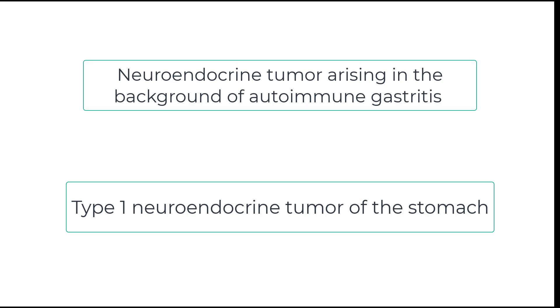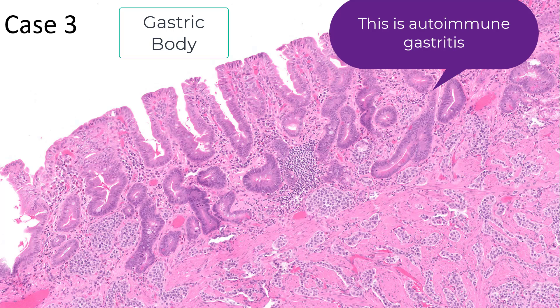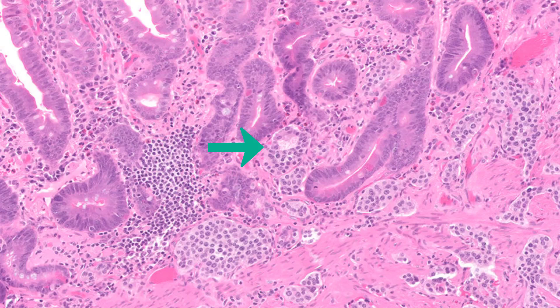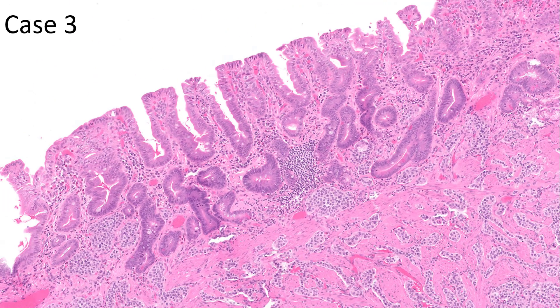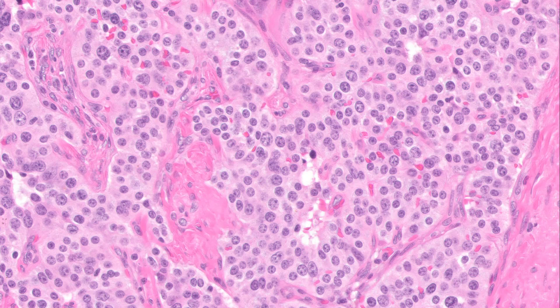Remember: type 1 neuroendocrine tumors are the best behaved of all neuroendocrine tumors in the stomach. Case 3 is a bigger piece of tissue from a gastrectomy specimen. There's complete atrophy — not a single parietal cell to be seen. This is the gastric body fundic mucosa. There's intestinal metaplasia, there's neuroendocrine cell hyperplasia, and perhaps deep down there's a neuroendocrine tumor. This is definitely a neuroendocrine tumor — it's forming nests, it's extremely monotonous. But type 1 neuroendocrine tumors of the stomach that develop in the background of autoimmune gastritis are very well behaved.